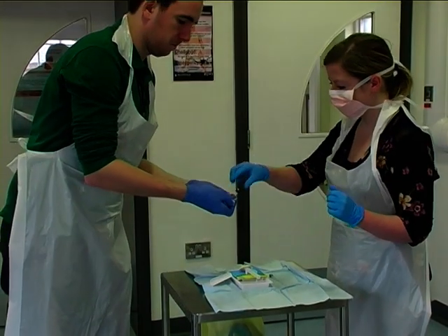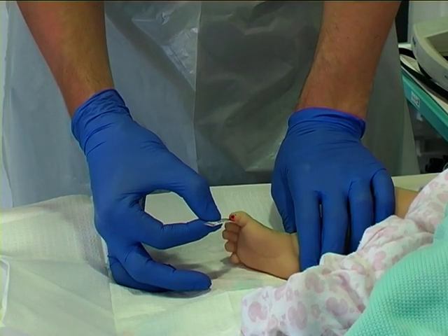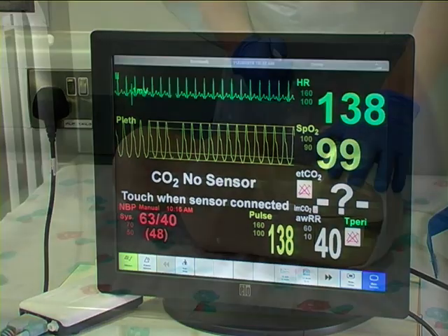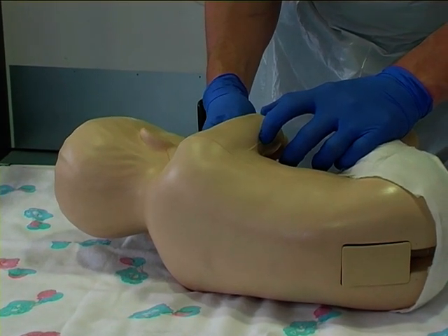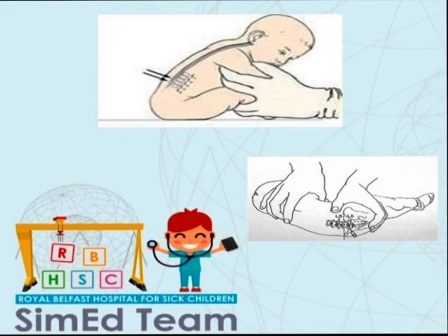Use of a non-stylet needle should be avoided. Prior to the procedure, it is important to obtain a blood sugar level. Having checked the blood sugar, you want to ensure that the patient's observations remain stable and it is then appropriate to administer pain relief such as sucrose for an infant patient.